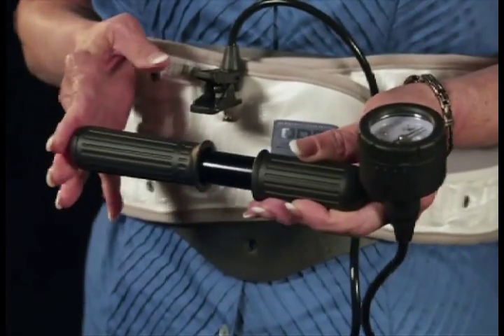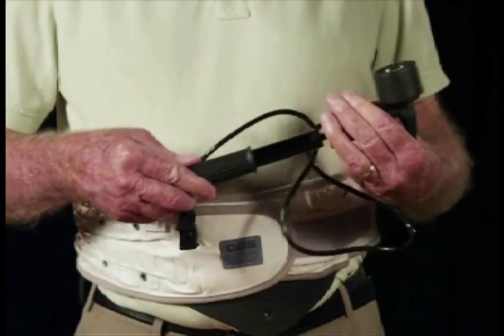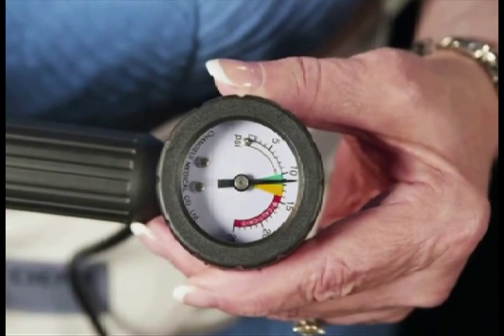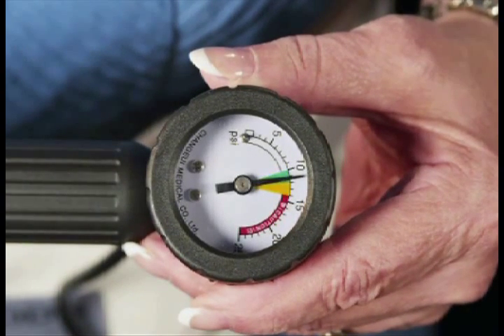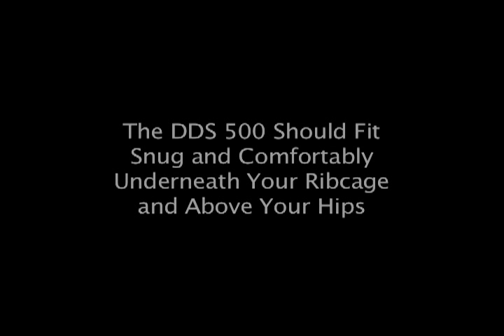Step 5. Inflate the belt using the hand air pump with short, easy strokes until the gauge on the hand air pump indicator reaches the green-orange area. Do not allow the gauge to go to the red area. You may adjust the DDS Belt according to your body type by adjusting the belt higher or lower on your abdomen.